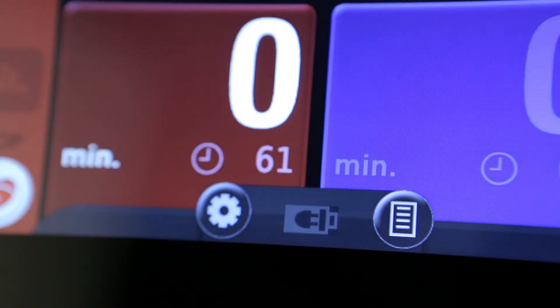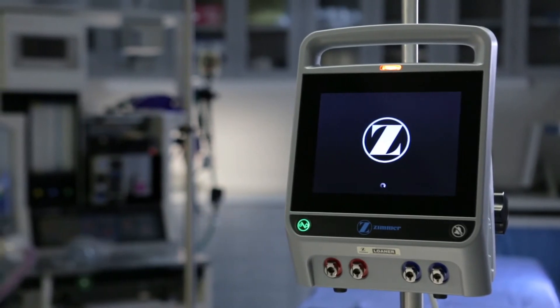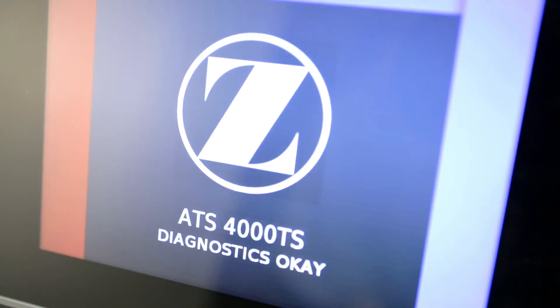When the unit is operating on battery backup, a battery status icon appears and displays the battery's current capacity. When the ATS 4000 is turned on, the unit automatically runs a self-test to check system hardware and software. The Zimmer Biomet Circle Z icon and a progress icon appear on the LCD display during this diagnostic check. After the diagnostic check is complete, the unit automatically checks its calibration.